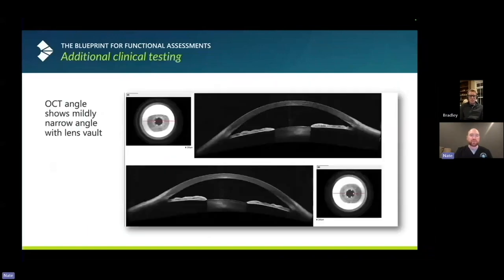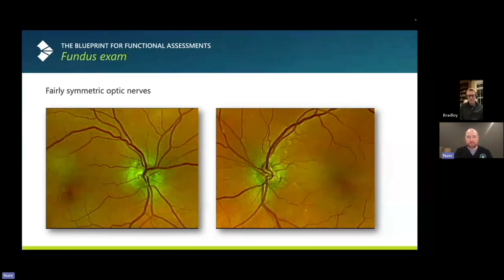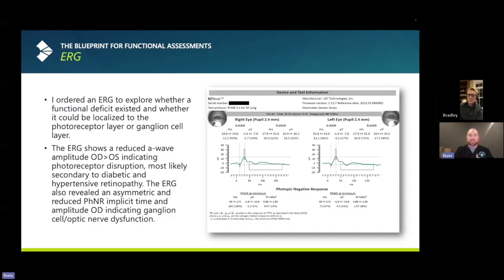You know, Dr. Grant, this is one where maybe the right eye is just a little bit more suspicious, but not ready to pull the trigger just yet. And to have that additional piece of data that agrees with the OCT, the ERG that says, boy, there's some dysfunction right eye more than the left eye. To me, this is really the straw that broke the camel's back, when you're on the fence. How many of you have been on the fence in glaucoma before? Is this glaucoma? Is it not? This helps to tip you one side or the other. In this case, I think this is glaucoma.